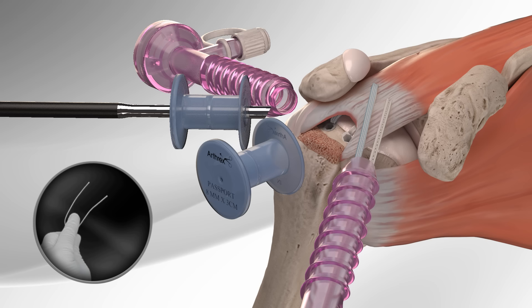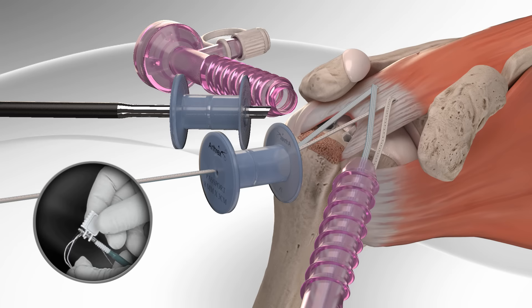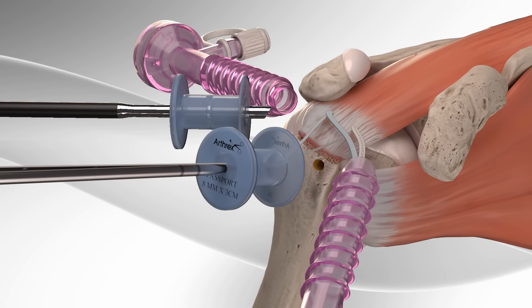The surgeon retrieves one fiber tape tail from each of the anchors and preloads the fiber tape tails into another swivel lock anchor. The surgeon then prepares the bone socket and inserts the biocomposite swivel lock anchor.